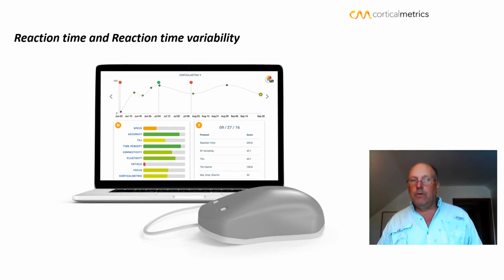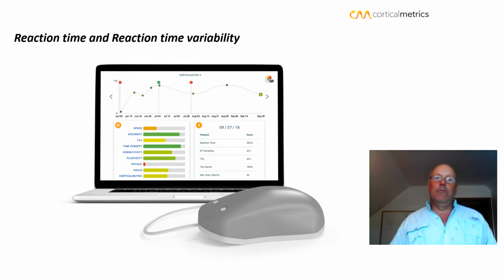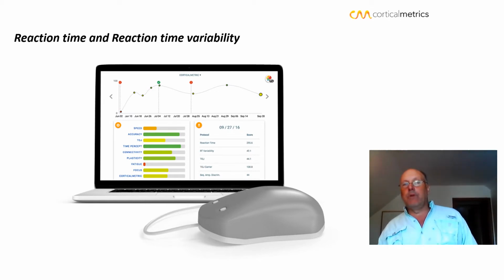For example, you may score 200 milliseconds on the first test, and then 200 on the next, and 200 on the next. In that case, your reaction time variability is 0 if you get the exact same score on all of them. However, if you score 200 on one, and 160 on another, and 240 on another, and it bounces around like that, then your reaction time variability may be around 40 milliseconds. So that's kind of high. Reaction time variability tells you very different things than reaction time, and I'll discuss that in a minute.